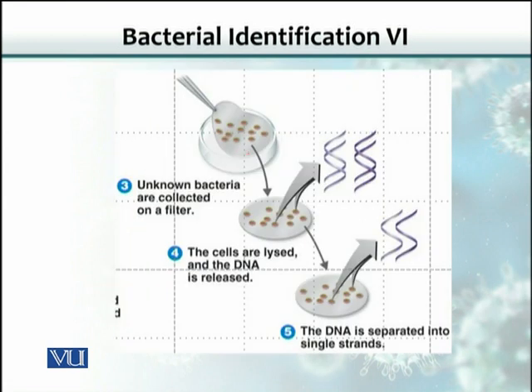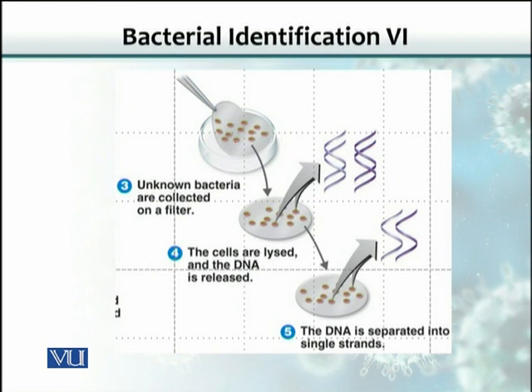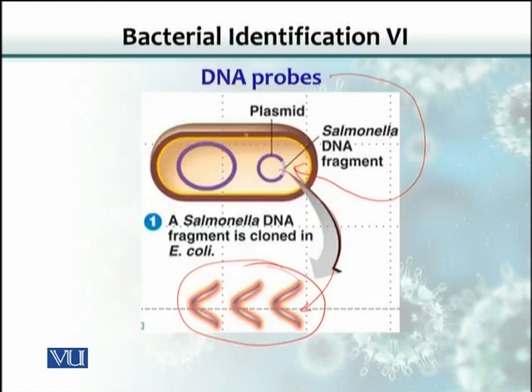Let's say this is a plate that contains hundreds of different colonies that we isolated from the sample. This could be a mixture of microorganisms, different species, or the sample could contain different contaminants along with the causative agent of a disease. What we can do is detect the presence of specific DNA in these colonies. As you know, this DNA is specific to Salmonella only.